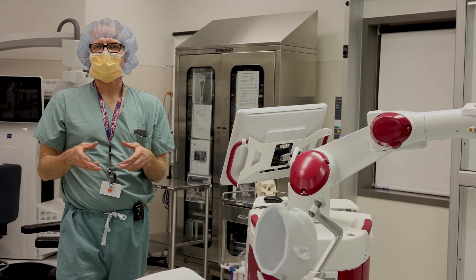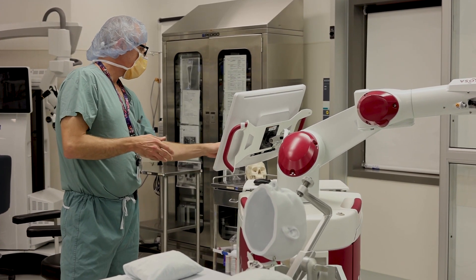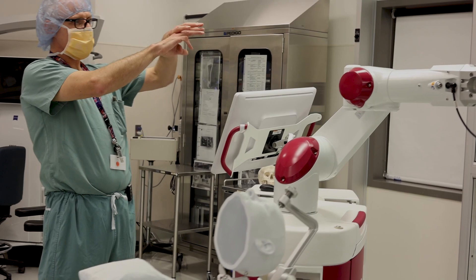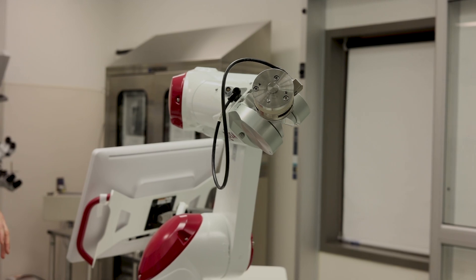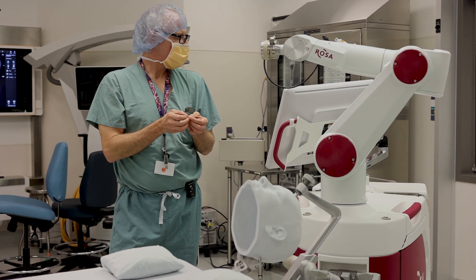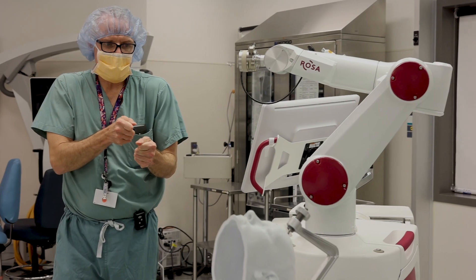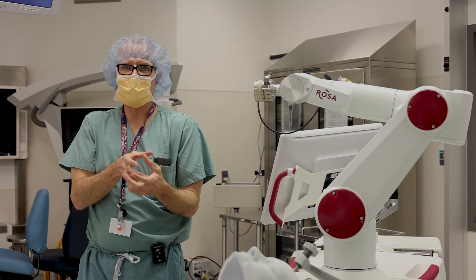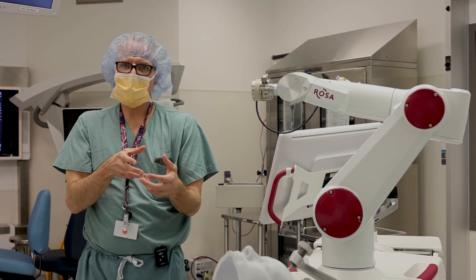Basically we're driving to the first electrode trajectory. So we push this button. Even the robot is draped in a sterile drape during the surgery. And then after that we can control it, but even when we control it, it is going to bring into the skin and just stop at the skin.